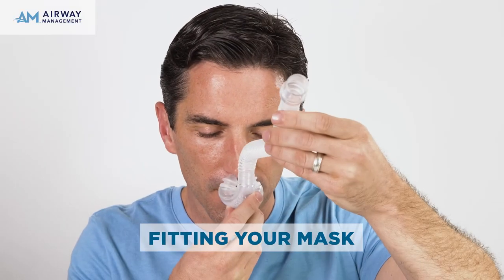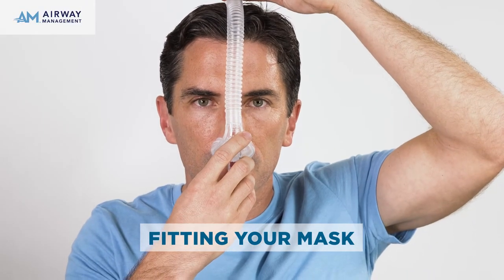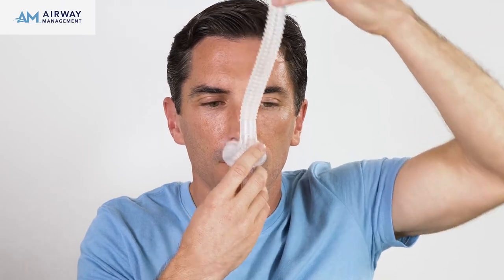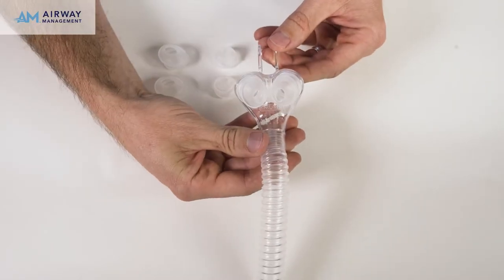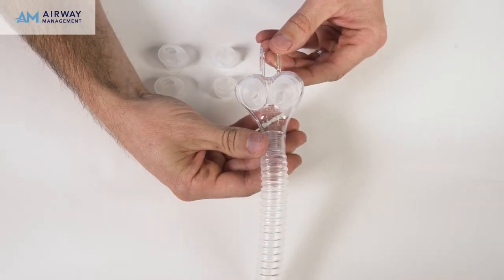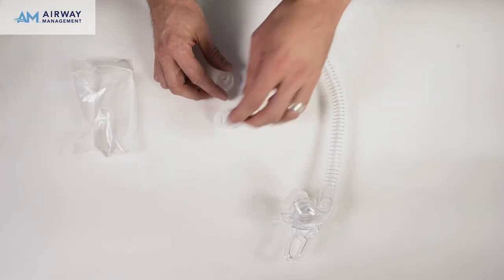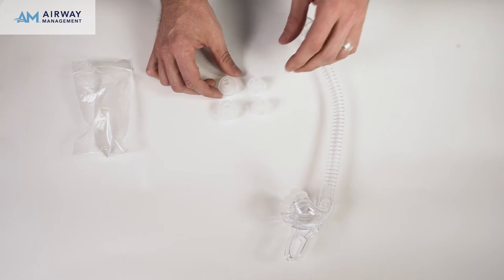Before reattaching the mouthpiece, check the size of the nasal pillow seals to your nares by holding the mask up against your nose. Ensure that the outlets fit into your nares and that the outer rim of the seal extends beyond your nares. Your mask comes preassembled with size medium nasal pillows. The nasal pillows are interchangeable, and small and large sizes are included in the package.